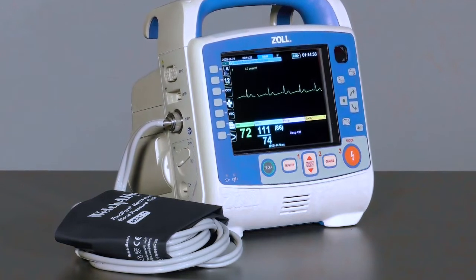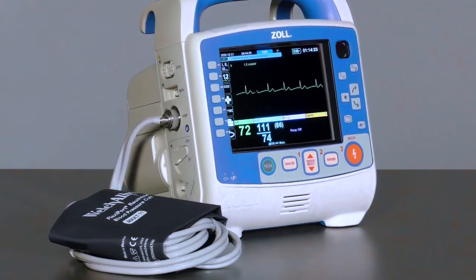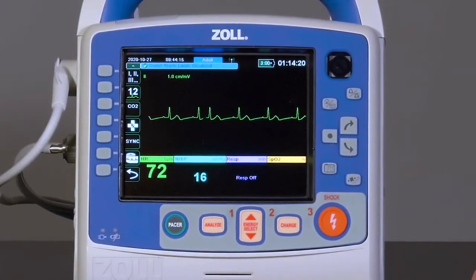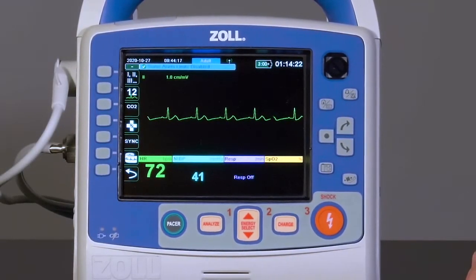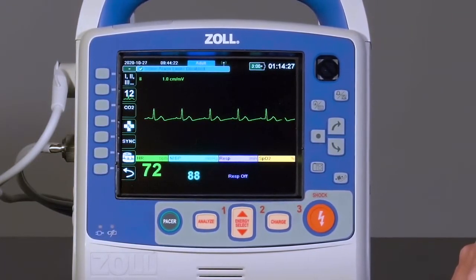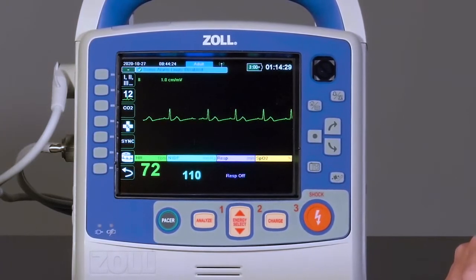The system allows for faster blood pressure measurement, provides more comfort for the patient, and is highly accurate. The Sure BP software allows the X-Series Advanced to acquire a blood pressure reading on the inflation, obtaining readings faster and with less patient discomfort.